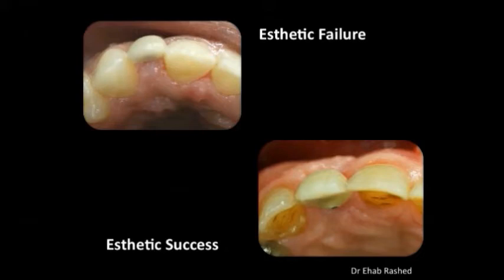She might have had good bone thickness if the implant was placed properly. She might have had quite a thick biotype, but it all went wrong, as one of the parameters for finalizing the implant and reaching a good aesthetic result was not followed.